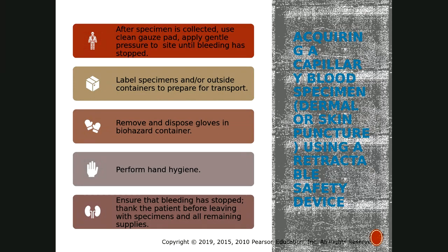Remove and dispose gloves in a biohazard container. Perform hand hygiene and ensure that bleeding is stopped. Thank the patient before leaving with specimens and all remaining supplies.